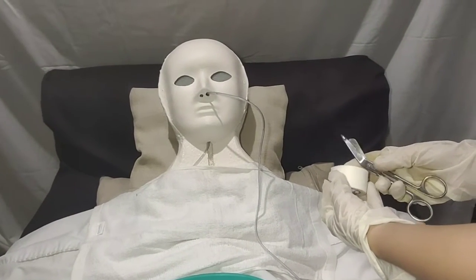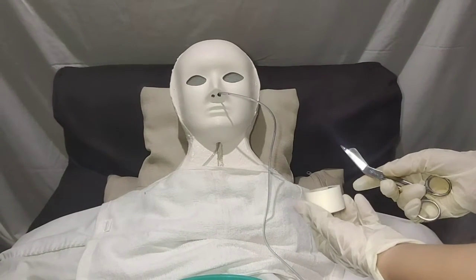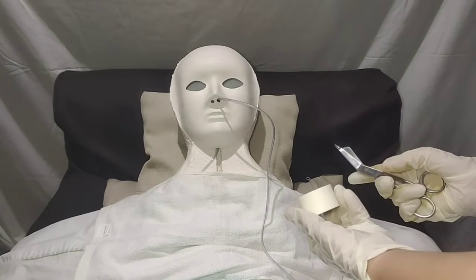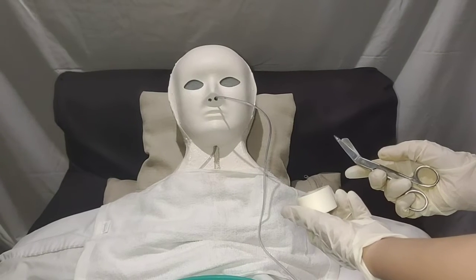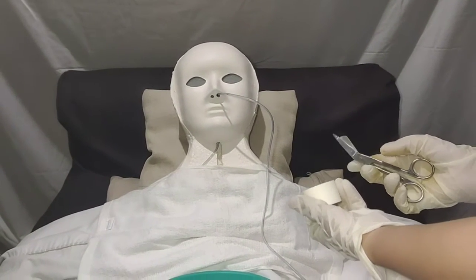To secure with tape, cut a 4-inch piece of tape and split bottom 2 inches, or use package nose tape for NG tubes. Place unsplit end over bridge of patient's nose and then wrap split ends under tubing and up and over onto the nose. Be careful not to pull tube too tightly against nose.